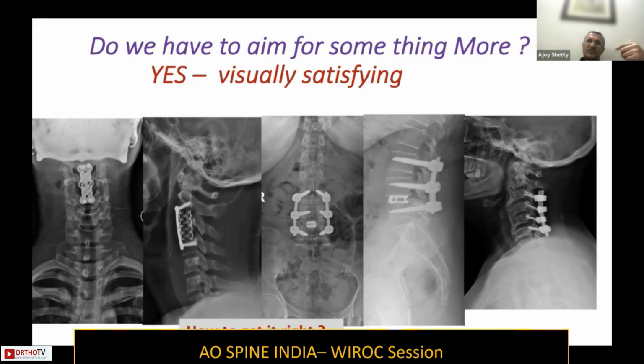The second way of identifying the midpoint is to feel the suprasternal notch and be sure that you are in line with it. That corresponds to an anatomical midpoint. The third way: the majority of the systems have temporary pins which can be placed, to verify that you have placed the plate exactly in the center.